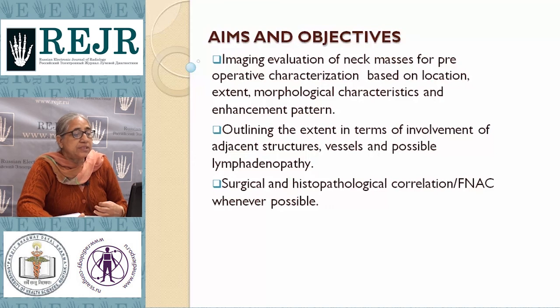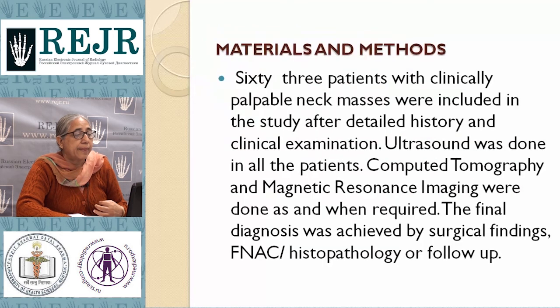Now we also did a study in our institute for evaluating neck masses for preoperative characterization based on location, extent, morphological characteristic and enhancement pattern, and to outline the extent in terms of involvement of the adjacent structures, vessels and possible lymphadenopathy. Surgical and histopathological correlation and FNAC where possible was done.